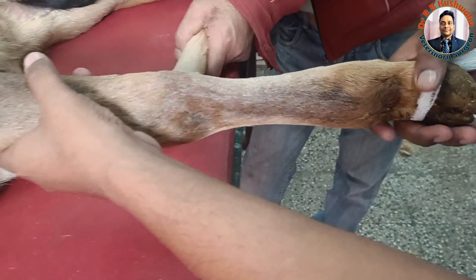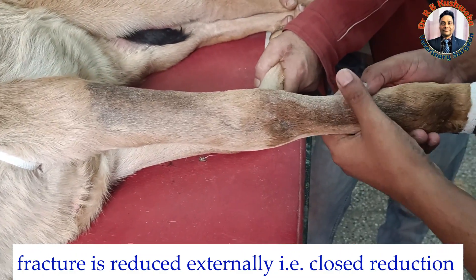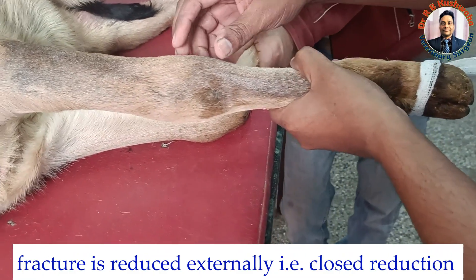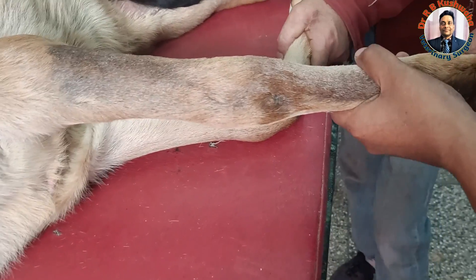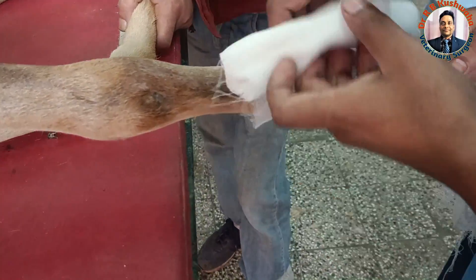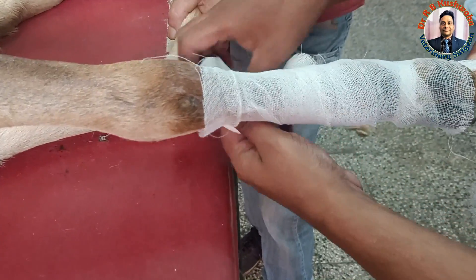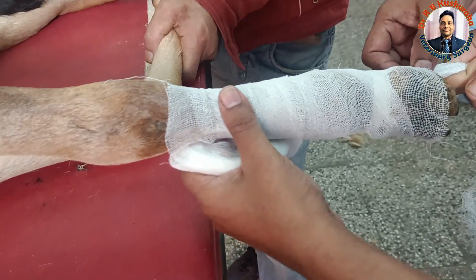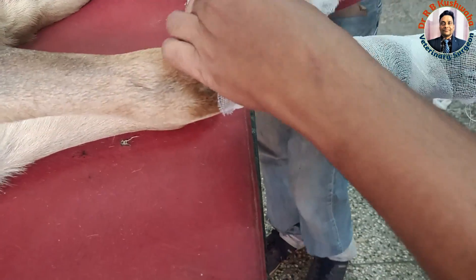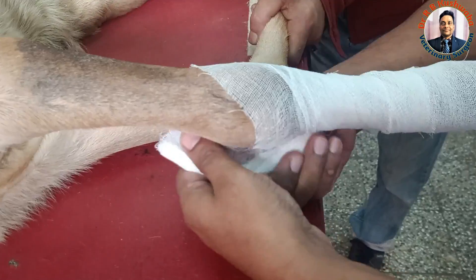We apply distraction and counter-traction to bring the fracture fragment into a reduced stage, with all other joints in normal anatomical position. We always start the bandaging from the distal end, including the hoof as well. Since we have applied the slip knot, it will come outside after completion of the procedure once the plaster of Paris is set and dry.